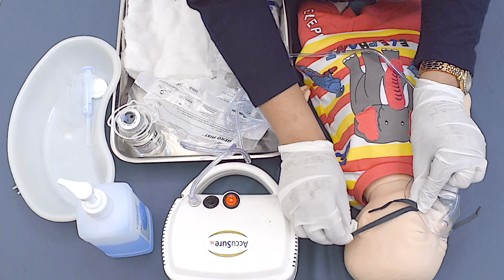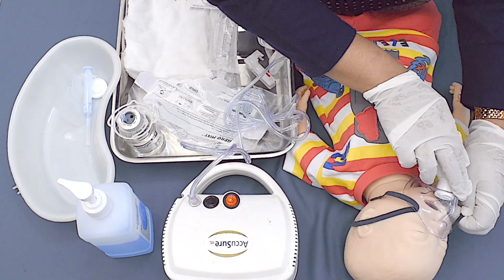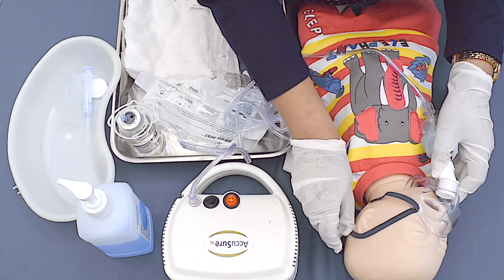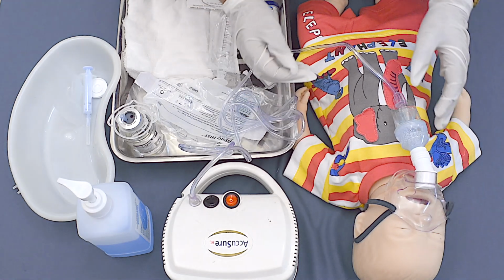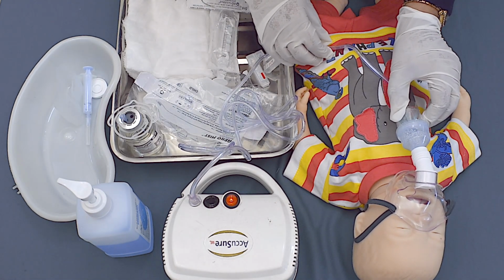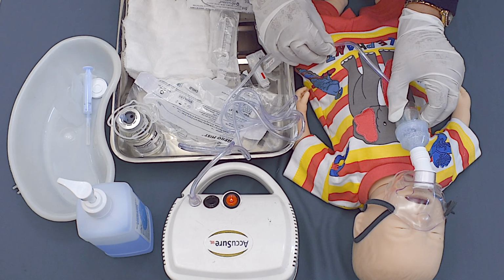It can be adjusted using the strings attached to the face mask. The strings should run over and behind the ear. Let the medication finish, and once the fumes stop coming, we can remove the mask of the baby.